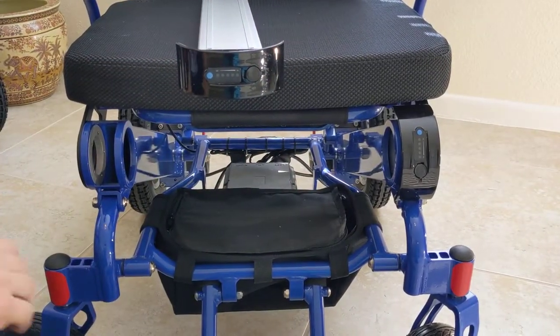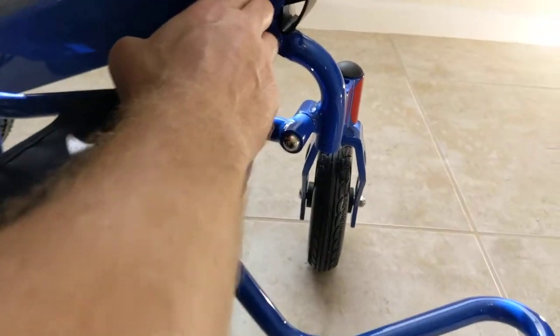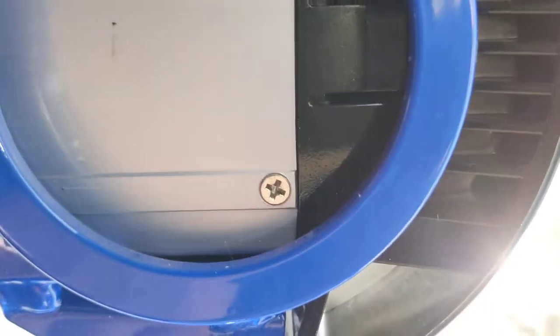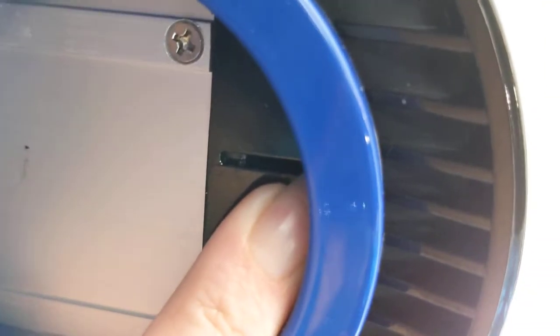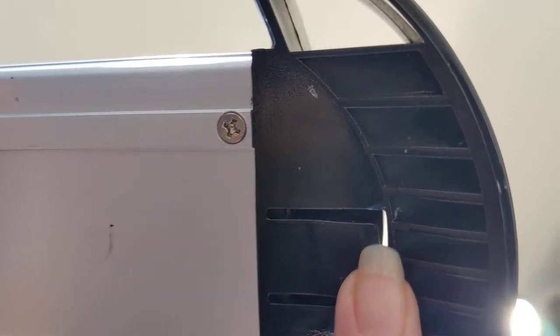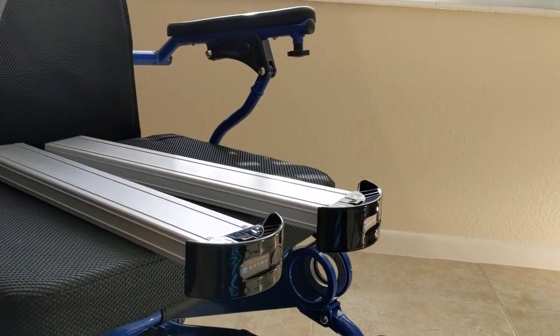Sometimes people find the battery a little stubborn to remove. There's a notch in the back of the battery compartment that holds the battery in and prevents it from sliding out on its own. The trick is to depress that notch fully enough so the battery slides out. You can see the notch on the side of the battery where the light shines through — press it down and the batteries come out simply and easily.